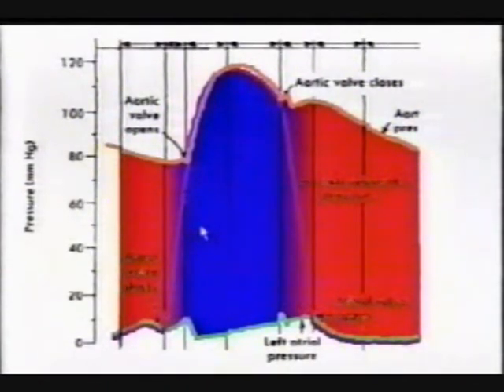Immediately before aortic valve opening and after aortic valve closure, there is partial flow in the coronary arteries. The shading in this area progresses from blue to red. The pressure gradients in the rest of diastole result in full coronary flow. They are shaded in red. But you may ask, what is the source of the pressure gradients during diastole?